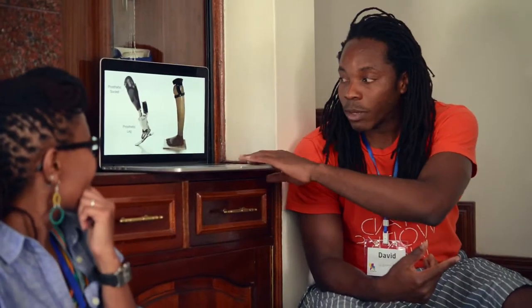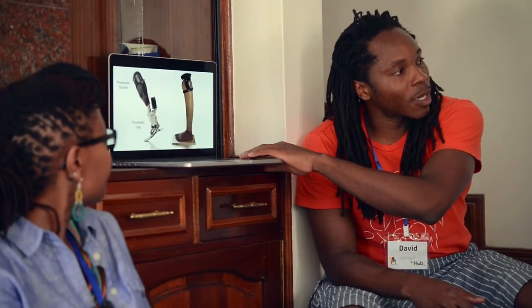David and I were just talking about doing a socket project, working on trying to use ultrasound imaging for prosthetic socket fitting, just because it's more accessible and low cost. We're specifically looking at ways that we can quantify that process, to take specific anatomical data from someone, whether it be medical imaging or looking at the tissue stiffness with robotic measuring tools, and then using that to guide the design process. Irrespective of what the prosthetic leg is, the socket is the most important part. If your socket sucks, you won't use your leg.